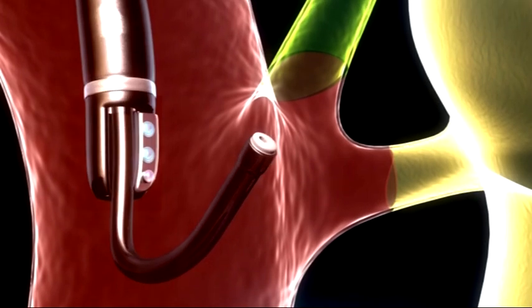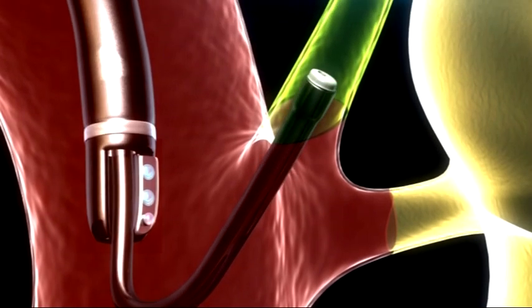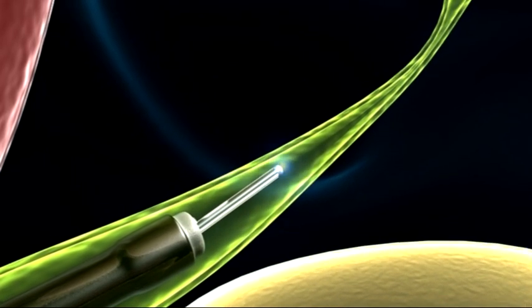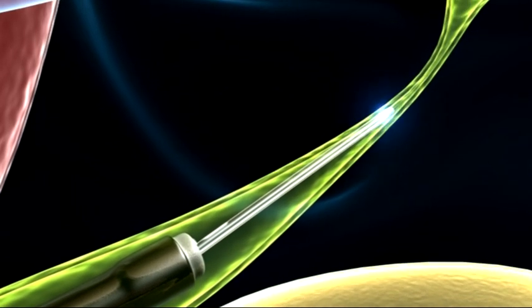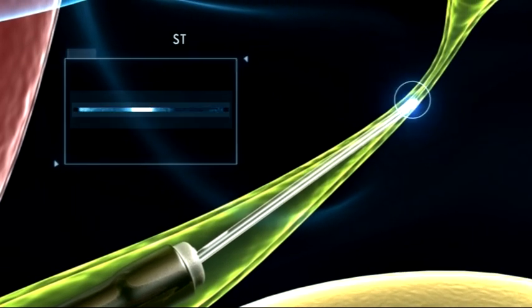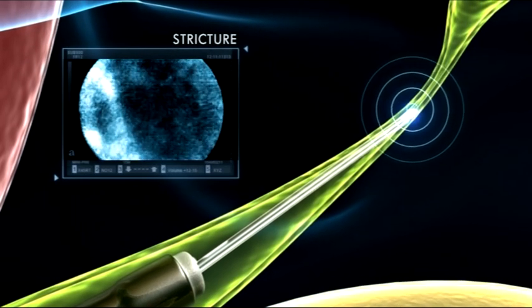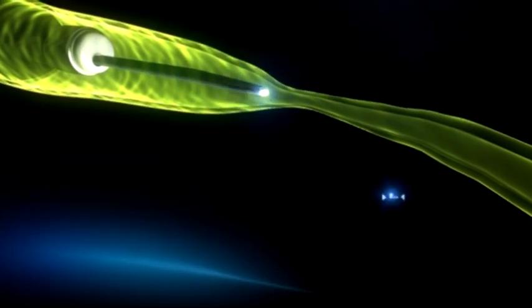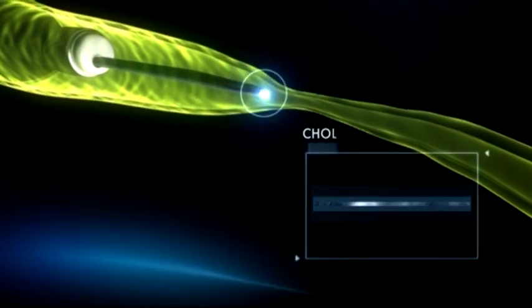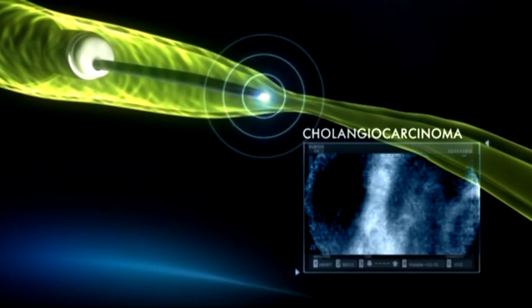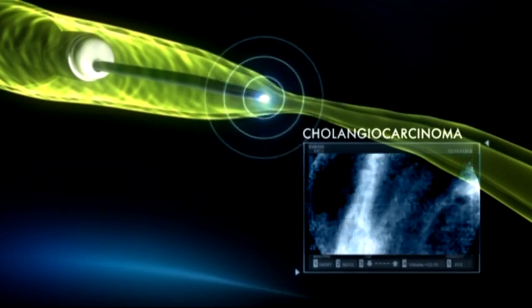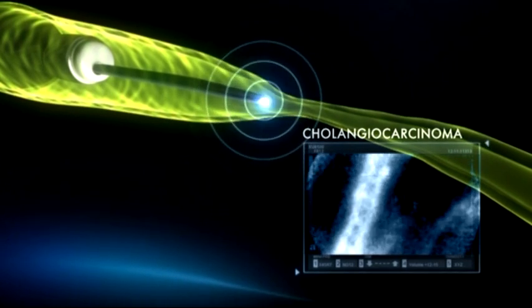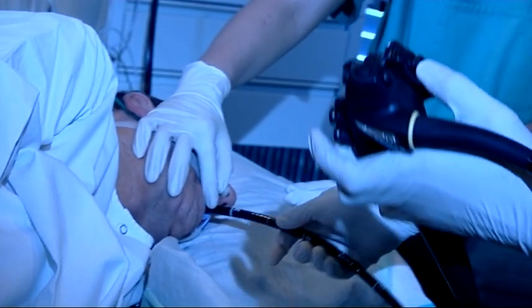Salvezio opens the black box of biliary and pancreatic strictures. When used during ERCP, Salvezio could improve stricture differentiation — for the very first time, it enables physicians to image lesions in the bile and pancreatic ducts at the microscopic level.